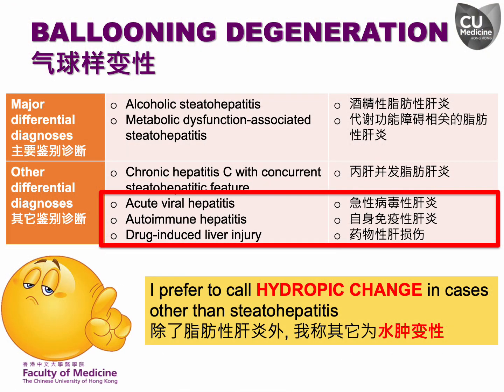Ballooning degeneration serves as the histological hallmark of steatohepatitis. Although similar morphological changes can be observed in hepatocytes affected by acute viral hepatitis, autoimmune hepatitis, and drug-induced liver injury, I prefer to designate them as hydropic changes because the swollen hepatocytes in these conditions do not exhibit a loss of their cytoplasmic expression of CK8/18. I reserve the term ballooning degeneration exclusively for describing steatohepatitis.